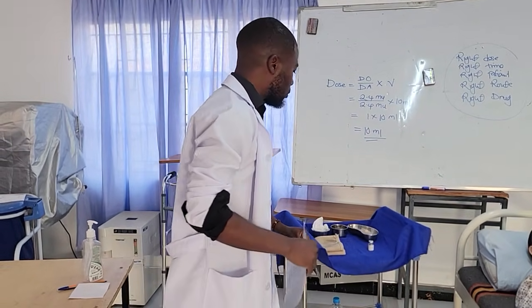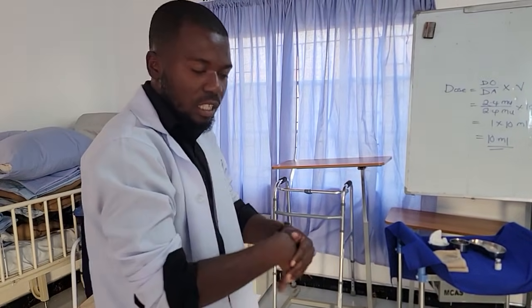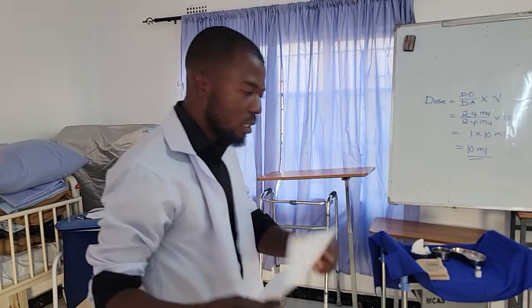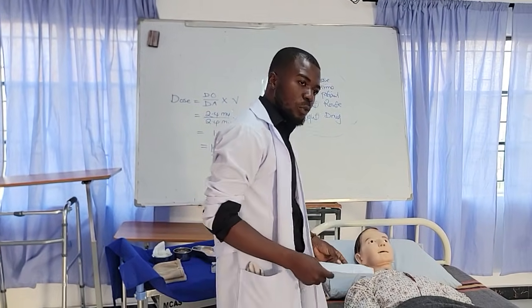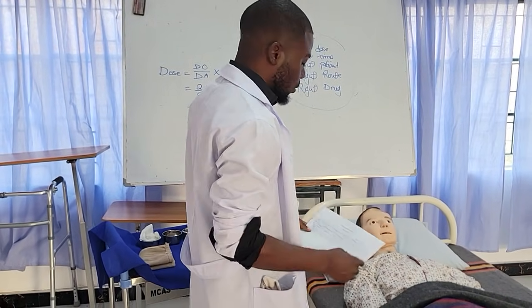So let's begin the procedure. First thing first, wash hands and dry them. Then you get the drug chart and go to the client or the patient. You are going to say good morning sir or good morning madam.